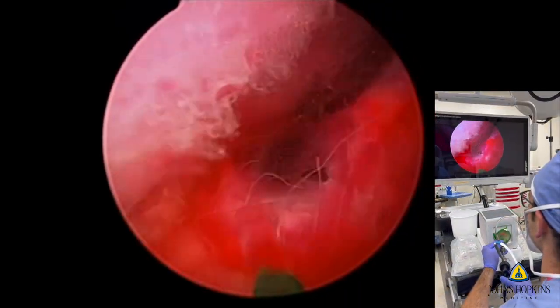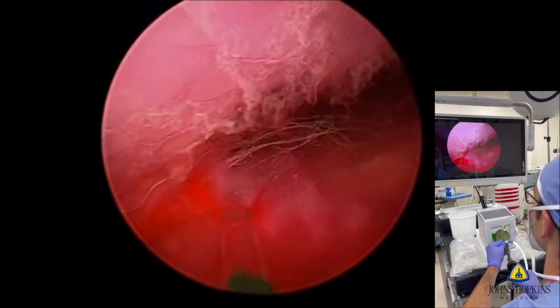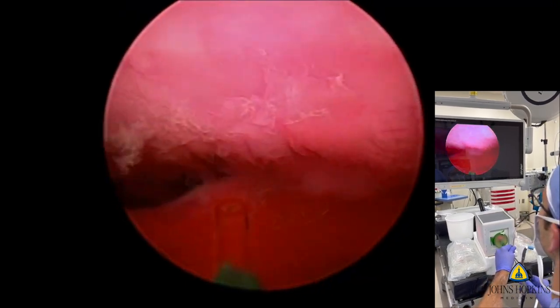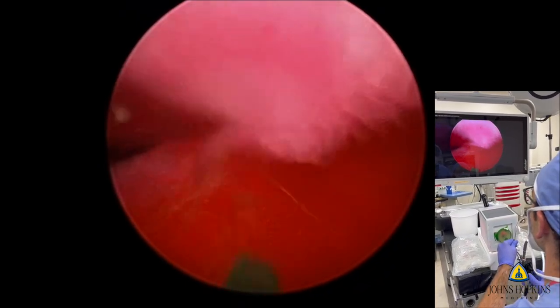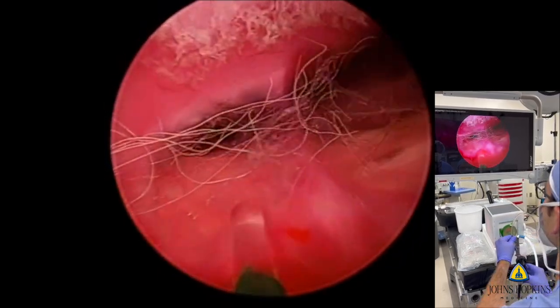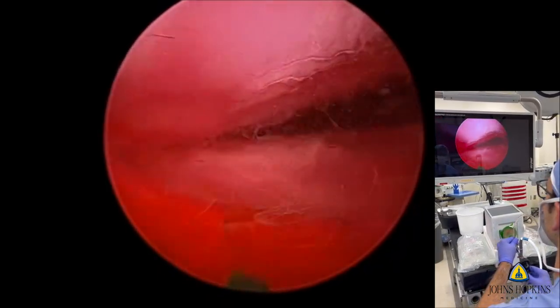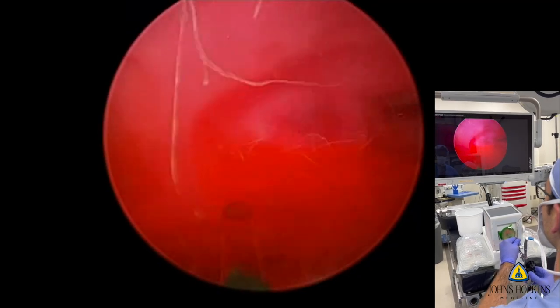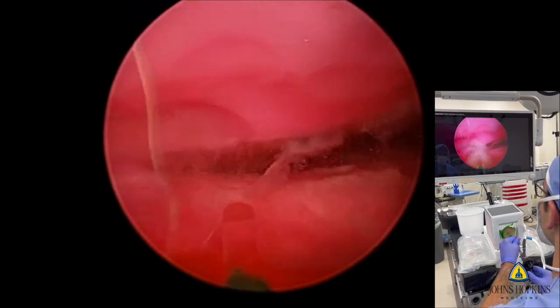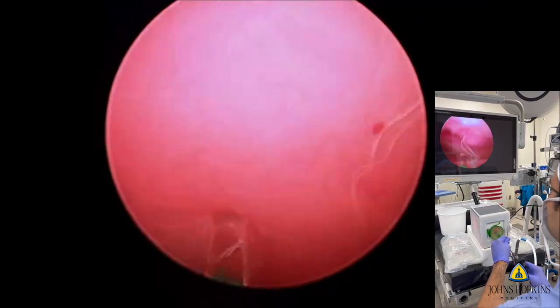Here is the final part where they're releasing the final attachments of the adenoma to the actual capsule, and this is at the bladder neck area at around 6 o'clock. You can see how they're able to use the laser to really target that area and not go sub-trigonal. Once all the attachments have been released, you'll be able to push the adenoma into the bladder and get that relief that you've done a complete procedure.